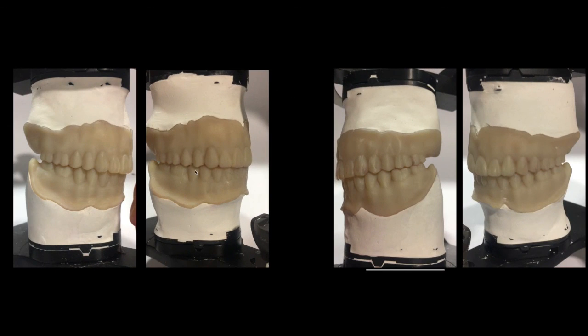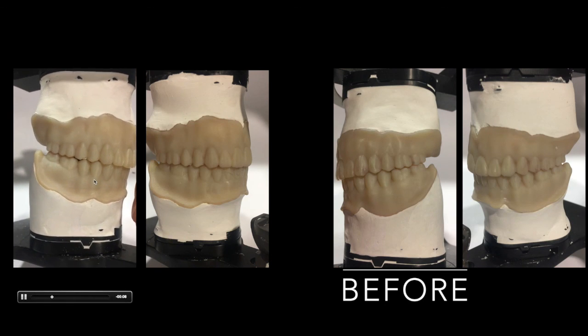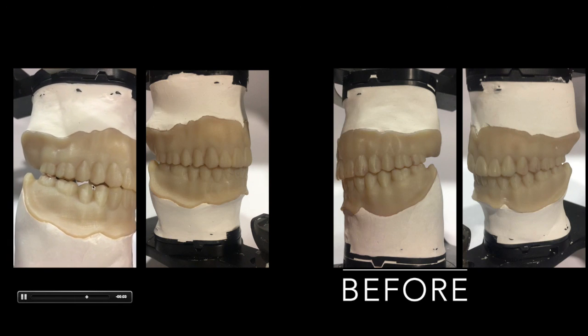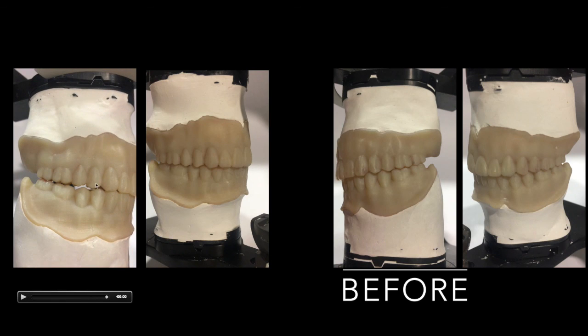So let's take a look. Initially on the working side, you notice only one and two in contact. None of these three teeth are in contact. So here you will see the mark over here and the mark over there. You need to continue adjusting this hyper contact until all these four teeth, the molars and the canine, are in contact, like here.